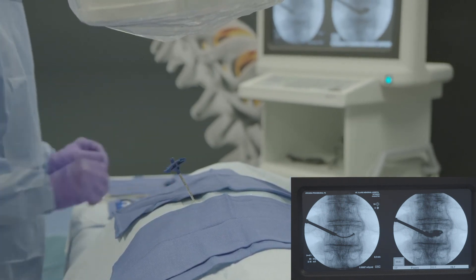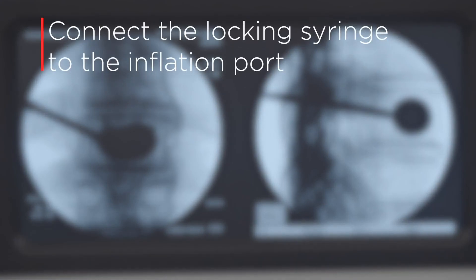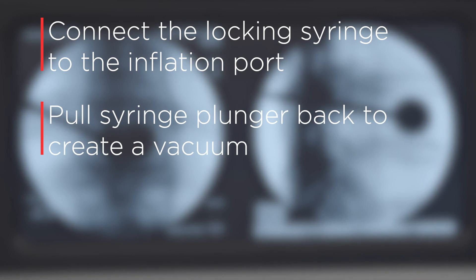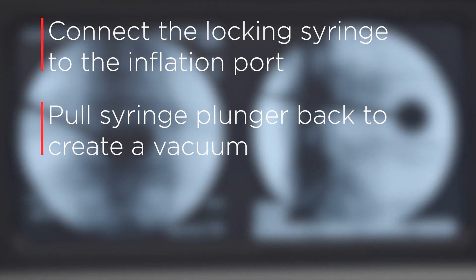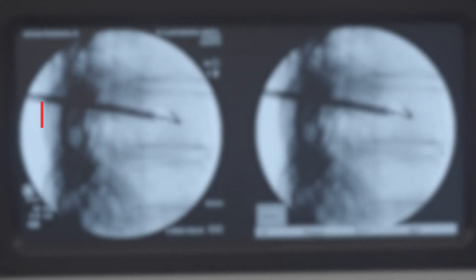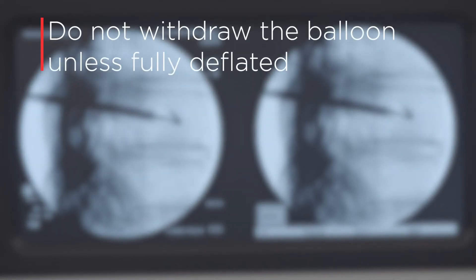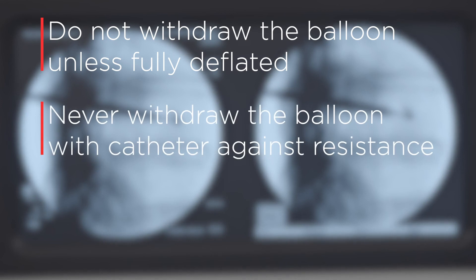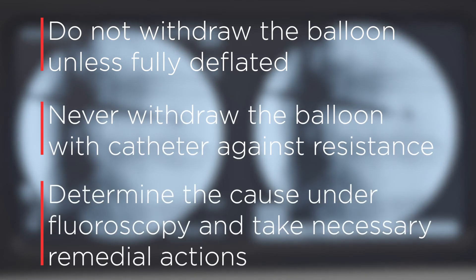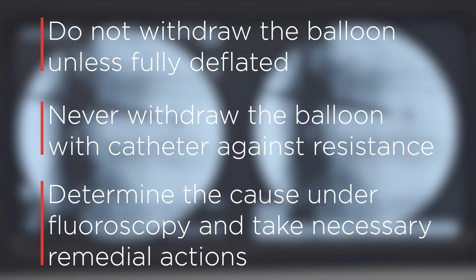If there is resistance, connect the locking syringe to the inflation port, pull the syringe plunger back, locking it to create a vacuum, and resume the balloon removal. Do not withdraw the balloon catheter unless it is fully deflated. Never withdraw the balloon catheter against resistance. Determine the cause of resistance under fluoroscopy and take the necessary remedial actions.